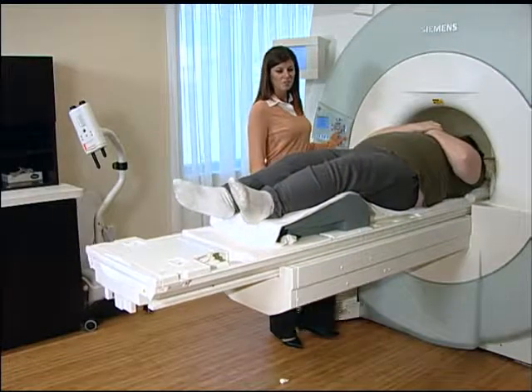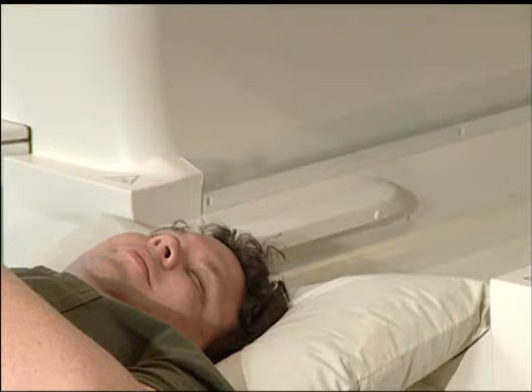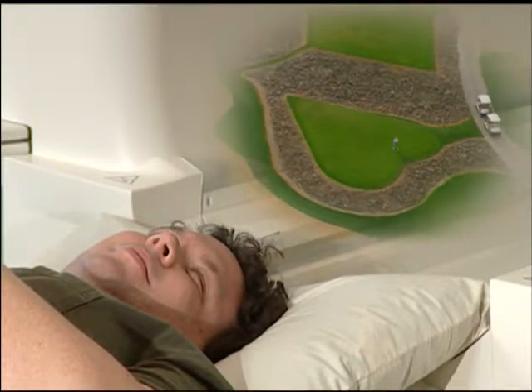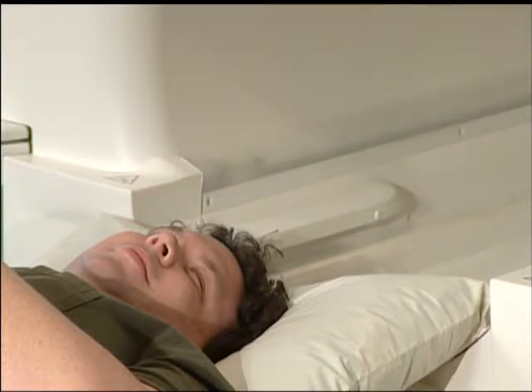Although the MRI exam is painless, it does require you to remain still until the exam is complete. Patients often try to nap. Mr. Smith enjoys golfing a lot. Perhaps he's thinking about his favorite course, concentrating on how relaxed he feels when he's playing. Think about something you enjoy doing. It really helps. Once complete, your magnetic resonance images will be processed and sent to your physician, who will discuss the results with you.